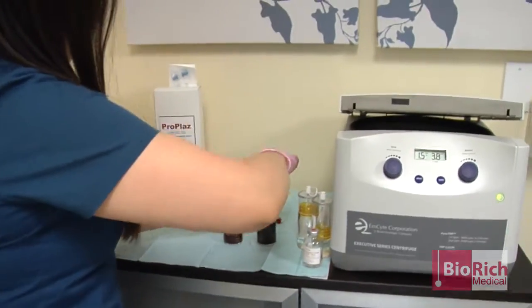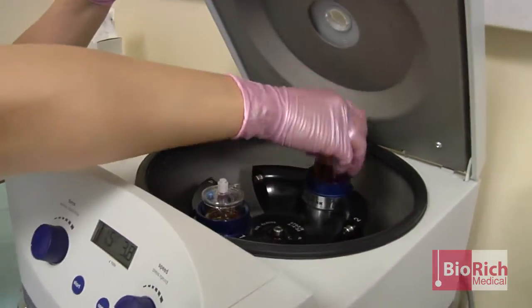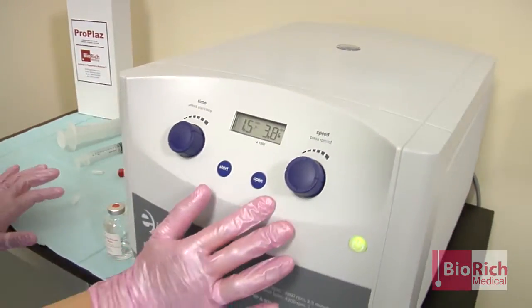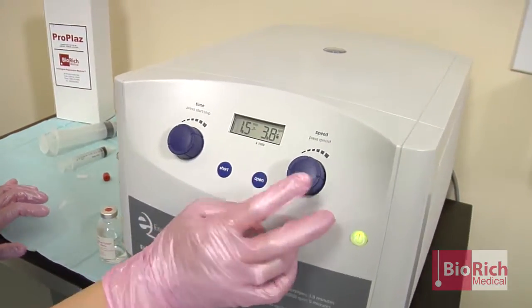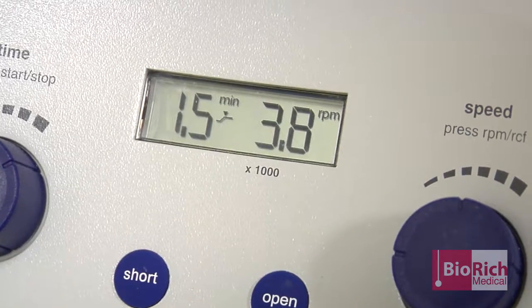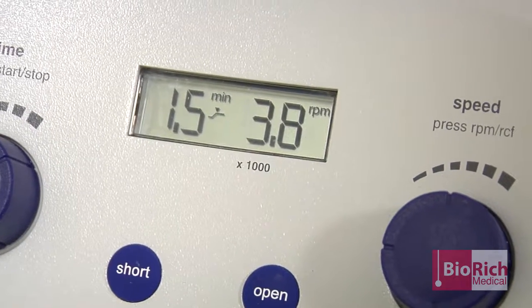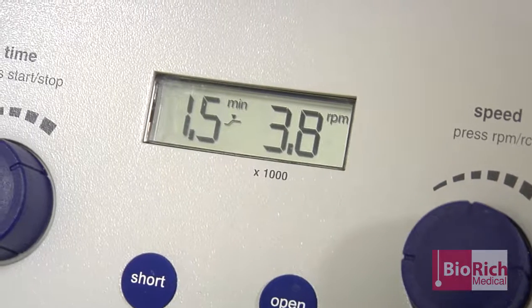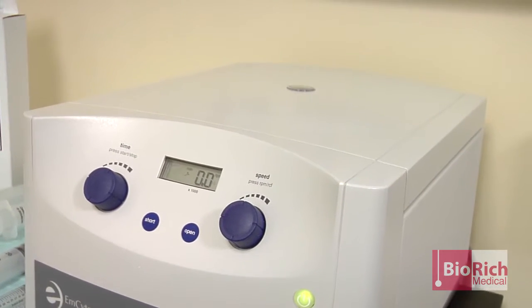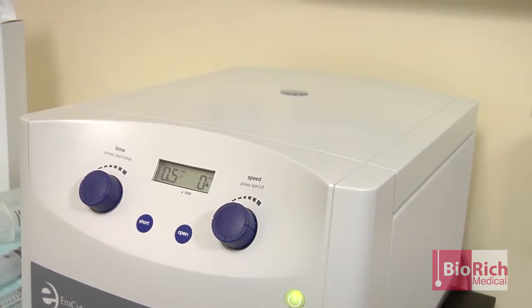We're going to put it in the centrifuge for one-and-a-half minutes at 3,800 RPMs. Now that it has reached the full RPMs, it'll spin for one-and-a-half minutes. The Executive 2 centrifuge, designed to work specifically with all of our devices — the precision process of the Executive 2 centrifuge delivers unsurpassed and reproducible performance.